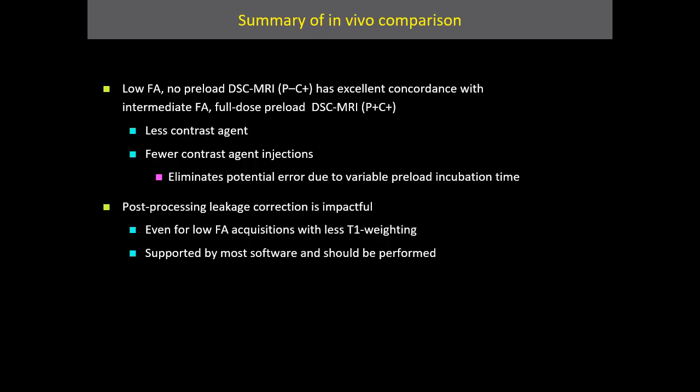And so we concluded from this comparison that a low flip angle, no preload DSC has excellent concordance with an intermediate flip angle full dose preload protocol. It requires less contrast agent and fewer contrast agent injections. And we also conclude that post-processing leakage correction is still impactful even for low flip angle acquisitions with less T1 weighting.